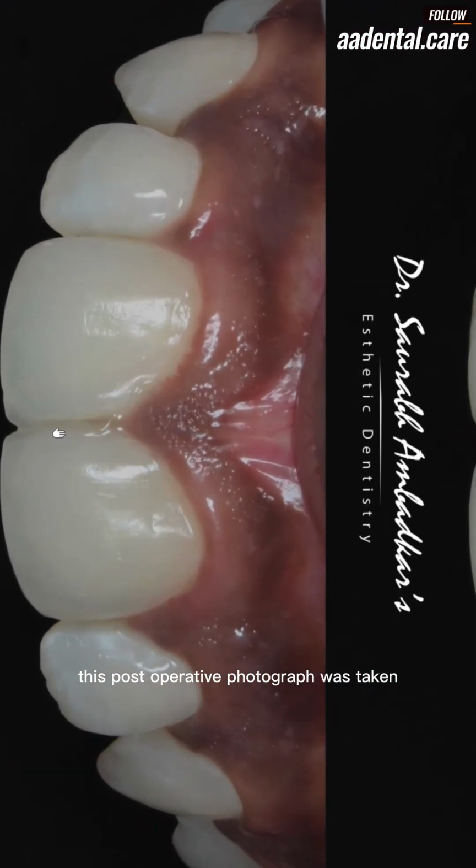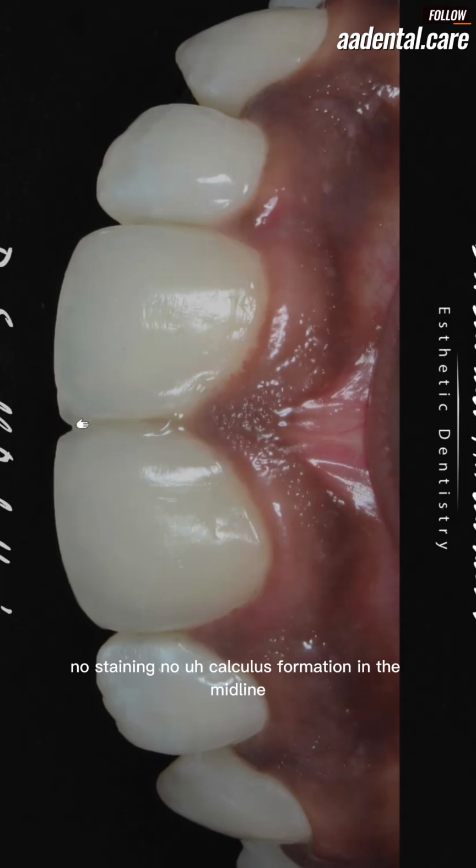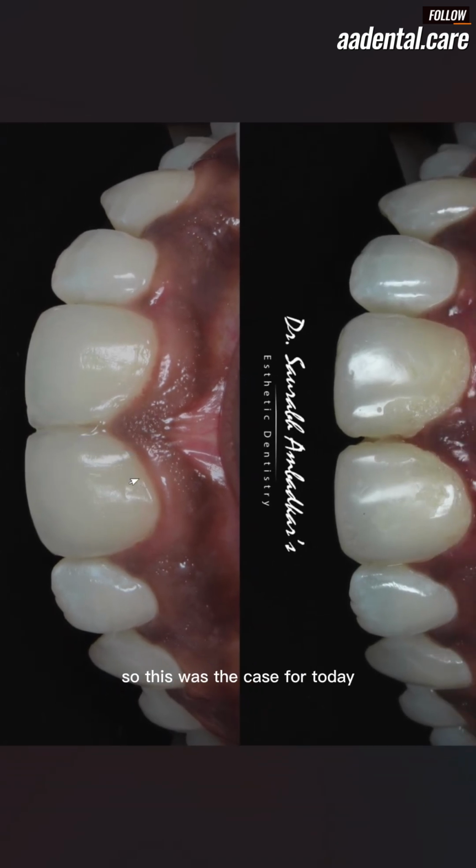This post-operative photograph was taken after 1 month of the treatment. You can see now also after 1 month the translucency is as it is, no staining, no calculus formation in the midline, no wearing off of the composite, finishing and polishing is intact. So this was the case for today.